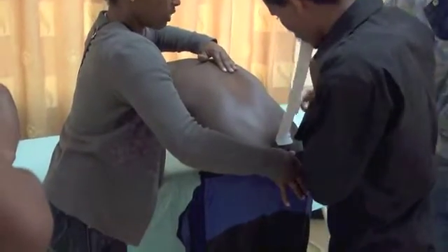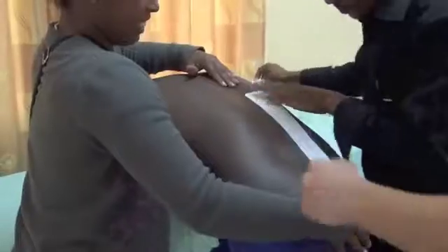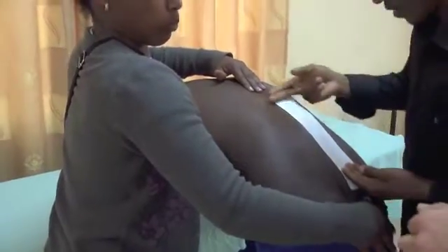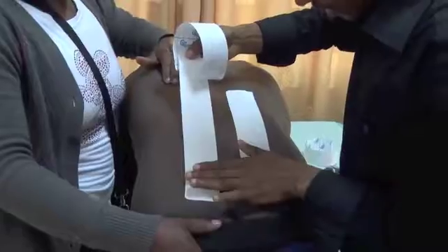Two centimeters. Two centimeters. Reposition the base. Very good.